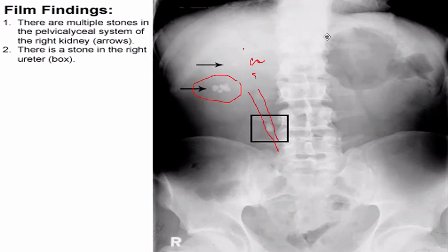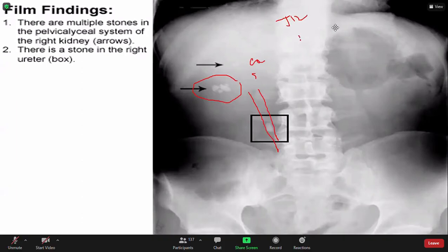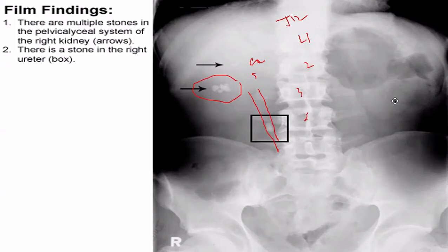This is the kidney, because I told you before, this is for all of you, that's why we are here. Look at what I told you before: the level of the kidney is at the level of T12 to L3. So this is the T12. If you see this one like a longer rib, that's the T12. So this must be L1, lumbar 1, 2, 3, 4, 5. This is the 5 because this is already the sacrum.